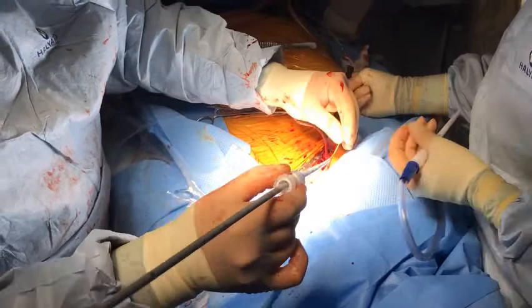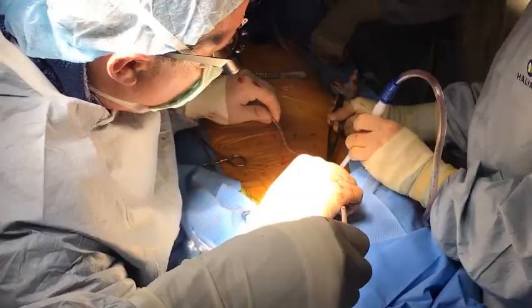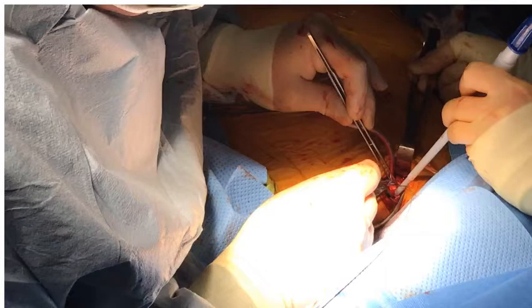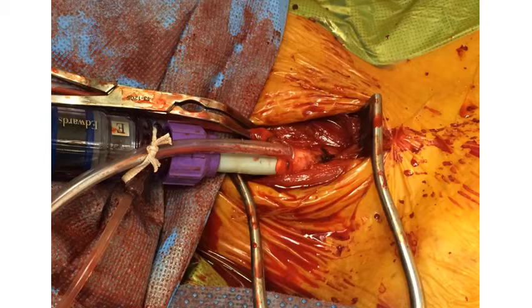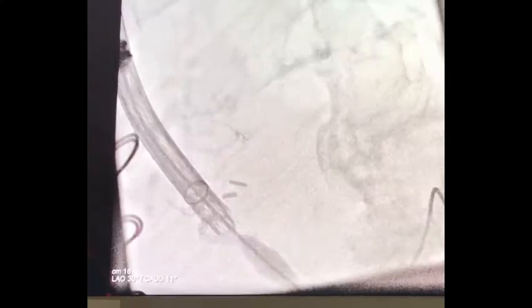Once the arteriotomy is completed, the sheath and dilator are advanced while slowly releasing the Rummel tourniquet, which allows the sheath to go in without much blood loss. You are now ready to put in the delivery sheath by first making a transverse arteriotomy with an 11 blade and finishing it with Potts scissors. This is what an Edwards sheath looks like when secured, in this case for a right carotid access.